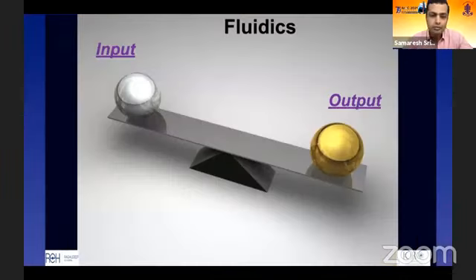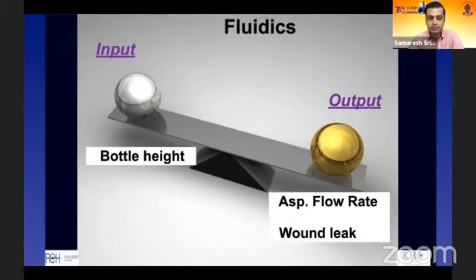Basics are basics. So we have to understand in terms of fluidics in phaco that input has to balance output, and that is how you control the entire surgery and prevent any surge and any complication during phacoemulsification.